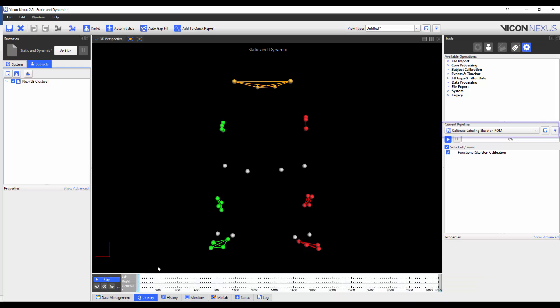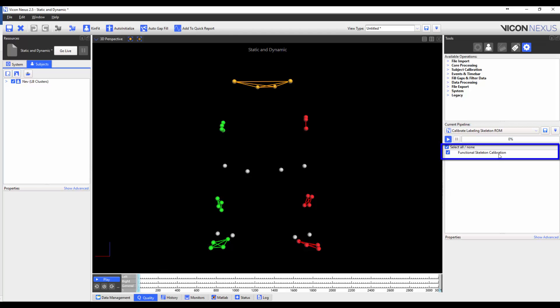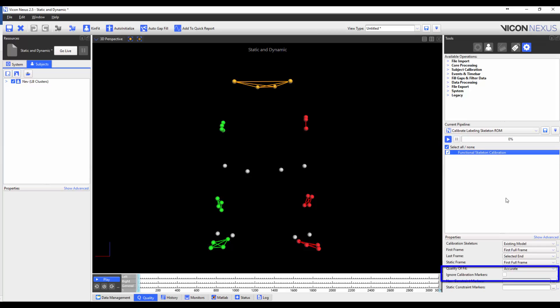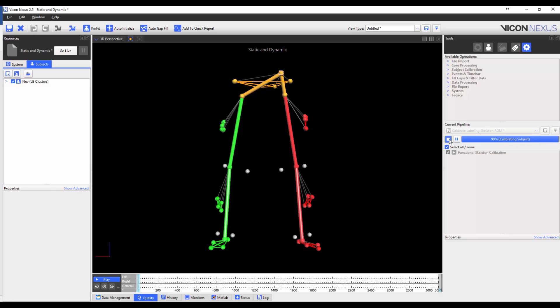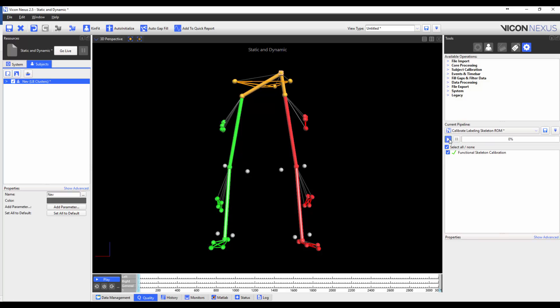Once this is done, I'm going to make sure that the calibrate labeling skeleton ROM pipeline operation is loaded, and I'm going to highlight functional skeleton calibration, and then I'm going to check 'ignore calibration markers.' This is because the knee and ankle joint calibration-only markers have been removed from the VSK. Once this is done, I can press play. Once the pipeline has finished running, I will save the subject and save the trial.